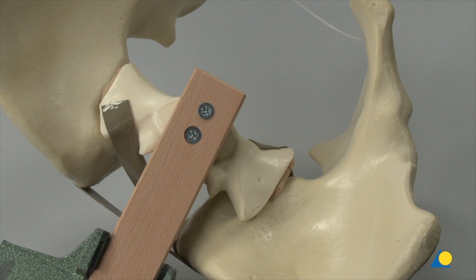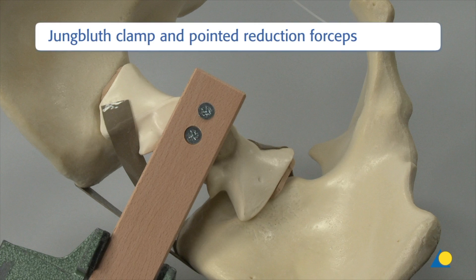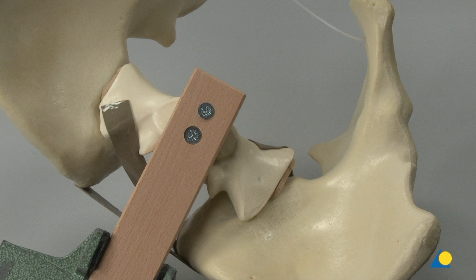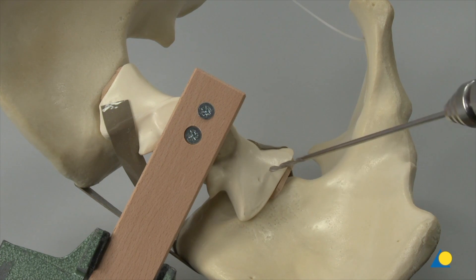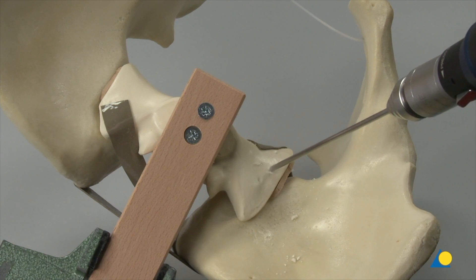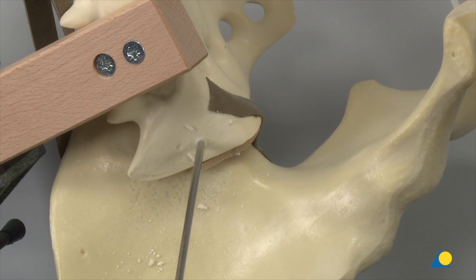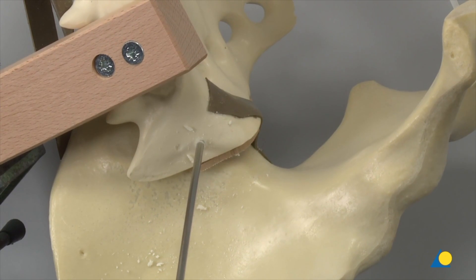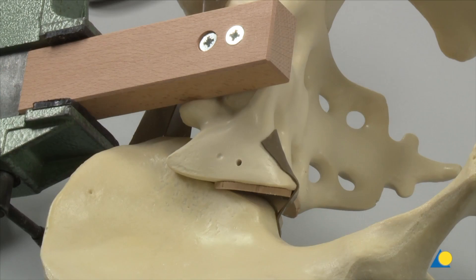Reduction using a Jungblut clamp and the pointed reduction forceps. Expose the lateral part of the sacral ala and drill a 3.2 mm hole respecting the spatial orientation of the sacro-iliac joint. The position of this hole should allow later plate placement proximally and distally to this anchoring screw.